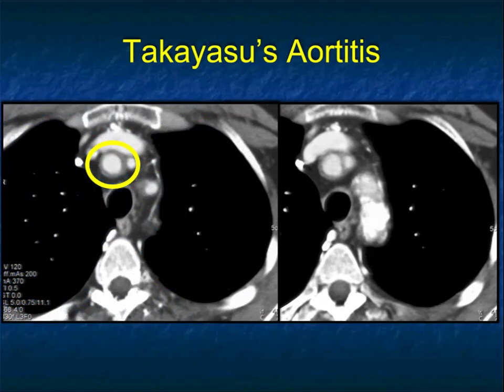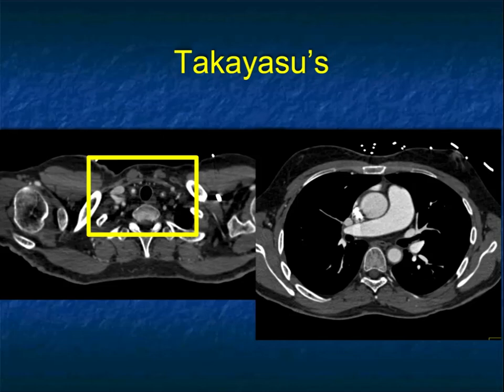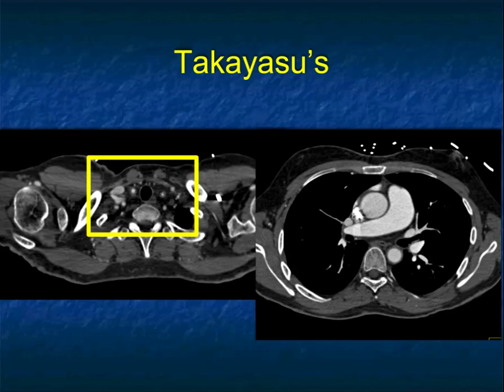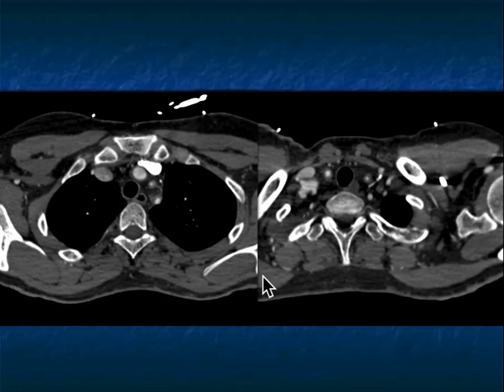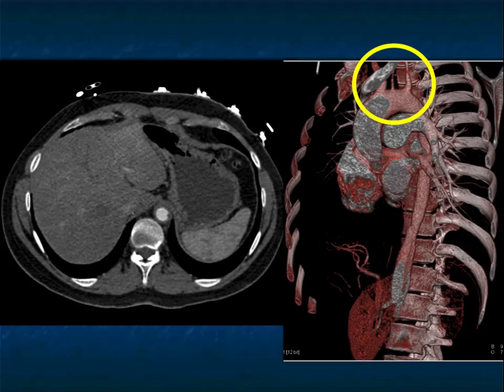Here's a nice example showing the thickening of the right innominate and the left subclavian off the arch. Look at the caliber of the patient's carotid arteries — they are very narrow, with almost minimal flow in the lumen. There's some thickening over the descending thoracic aorta as well. Additional images of the left carotid and subclavian artery really show this concentric thickening, and with that thickening you see narrowing of the lumen — very classic in Takayasu's.